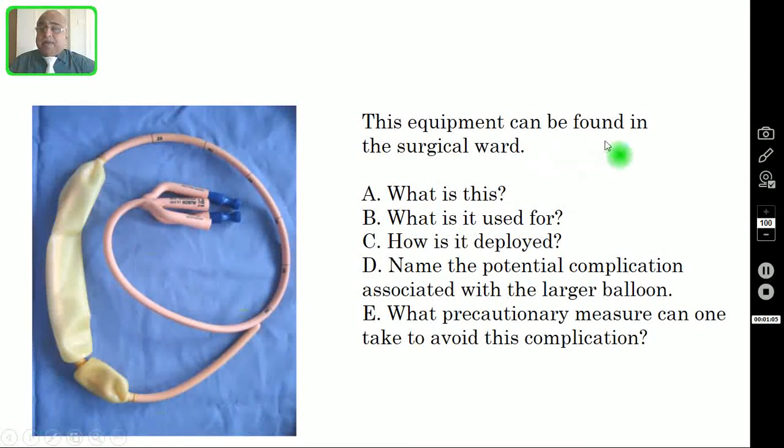This is an equipment that can be found in the surgical ward. Question number one: What is this? Question number two: What is it used for? Question number three: How is it deployed? Question number four: Name the potential complication associated with the larger balloon. Question number five: What precautionary measure can one take to avoid this complication? Pause this video and try to answer all five questions, then verify your answers in the subsequent slides.